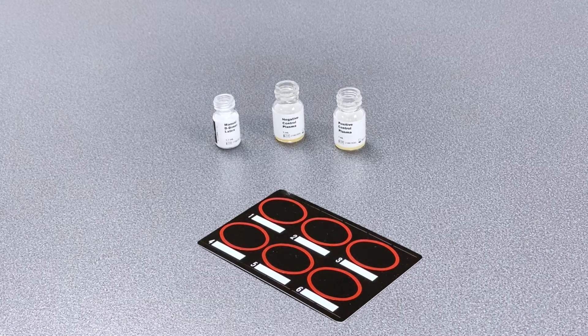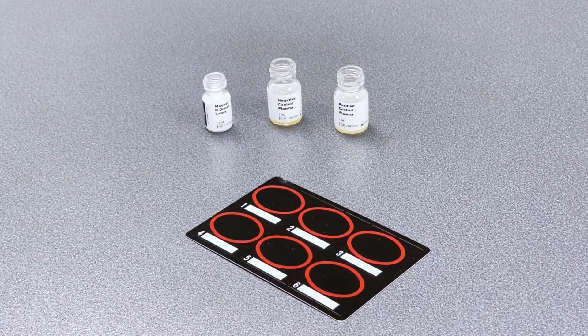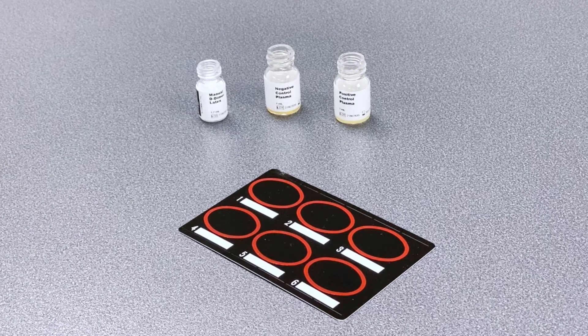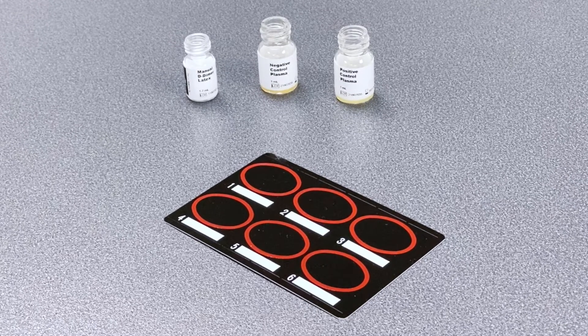The same kit can also be used for a semi-quantitative method, using the numbered positions to record a set of dilution ratios. A table of reference values is provided in the kit to make your determination.